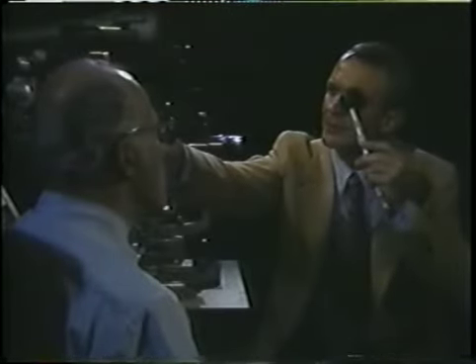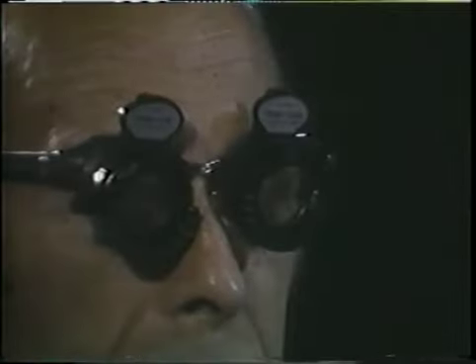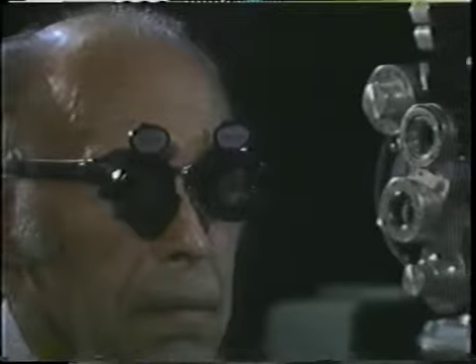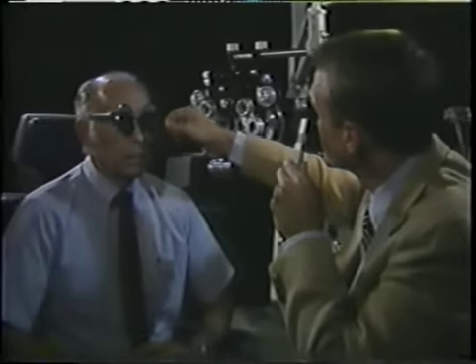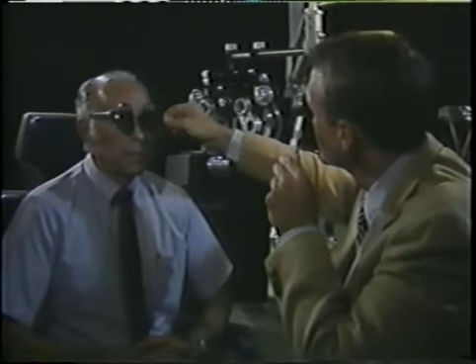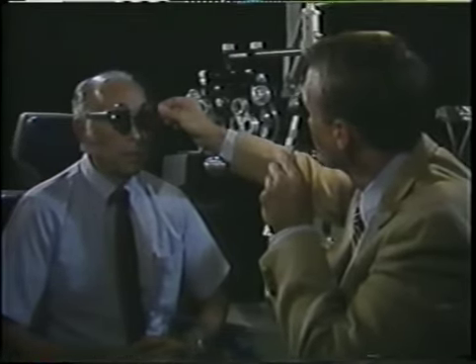Over-retinoscopy can also be performed with greater accuracy of axis settings with trial lens clips on the glasses. This is especially useful when refracting over high-power glasses where the over-refraction technique is so important in controlling the effects of vertex distance and pantoscopic tilt.